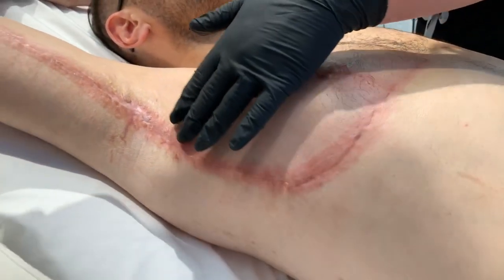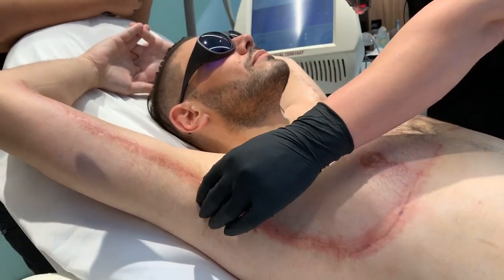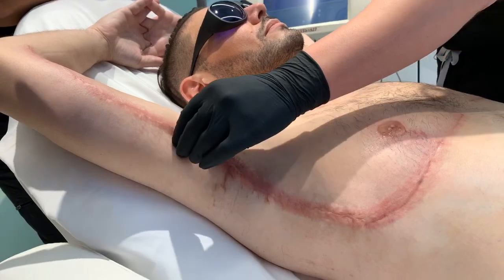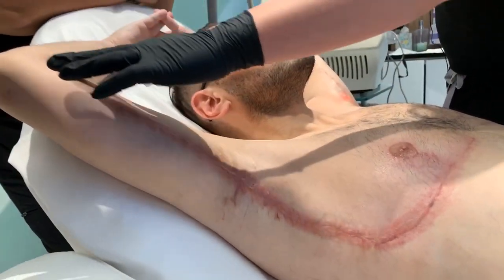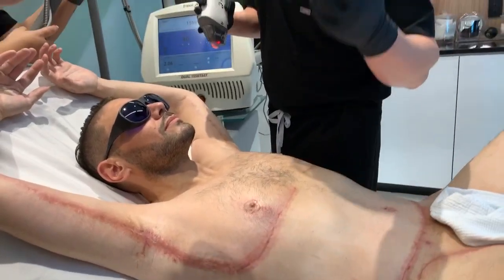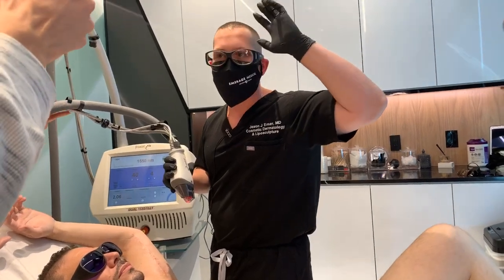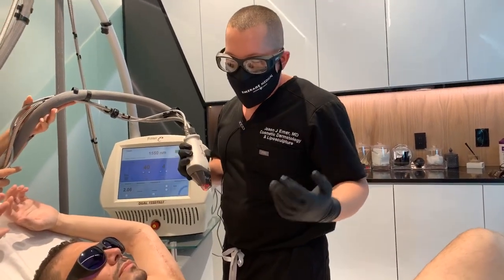What happens with a lot of the scars, especially over areas of movement, is there's some webbing that forms, and some scar tissue that forms with induration underneath. So not only do we want to improve the appearance of the scar, we also want to improve the underpart of the scar, so it makes it easier for him to raise his arms and just have overall better movement in his body.